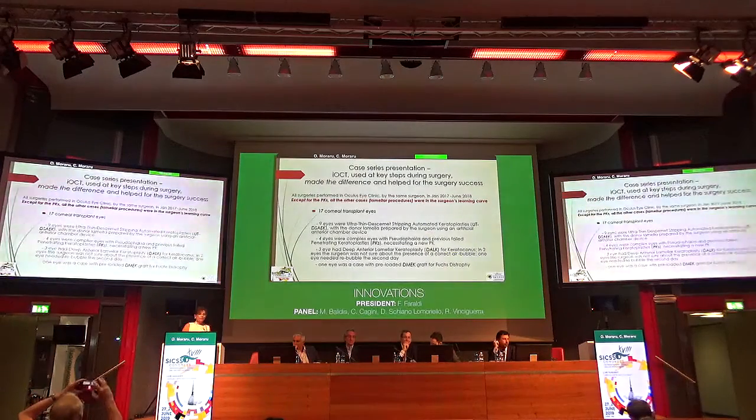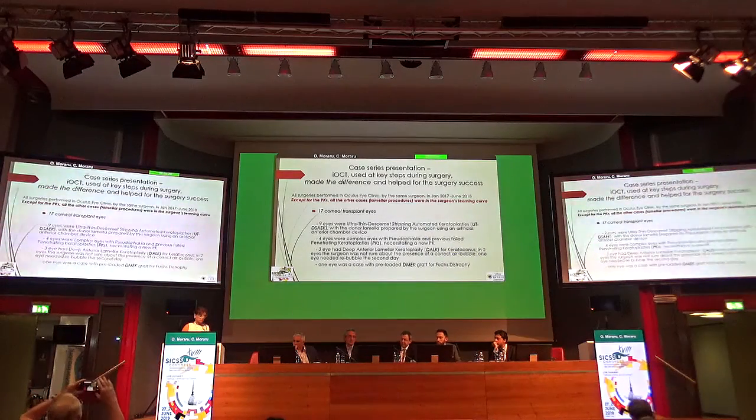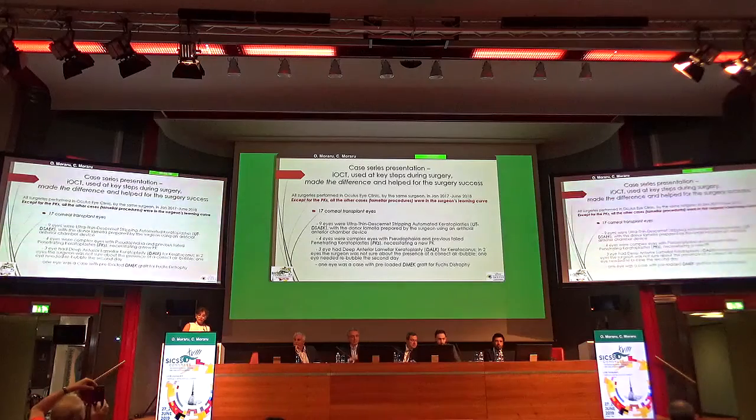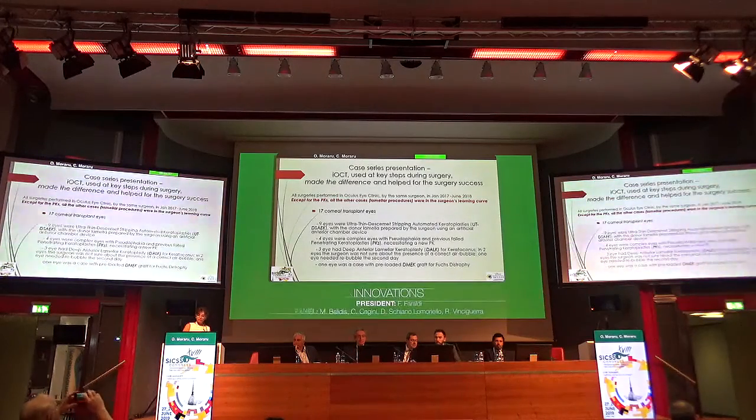I've chosen for this presentation some of the cases in which I think this intraoperative live OCT really helped me in making decisions. Except for the PKs, all the other cases, the lamellar procedures, were in my surgeon learning curve.